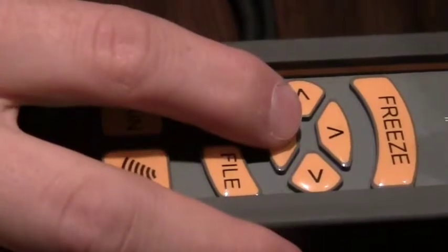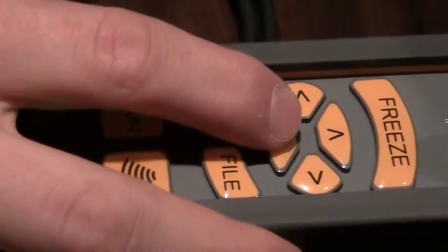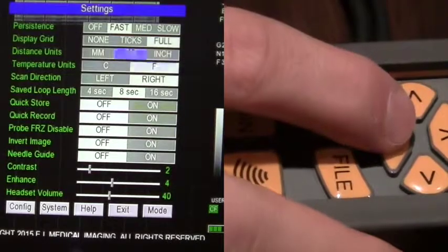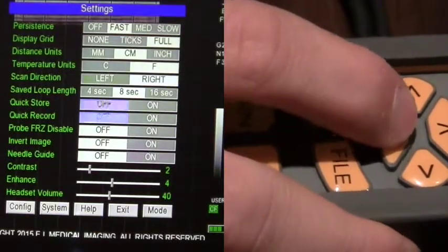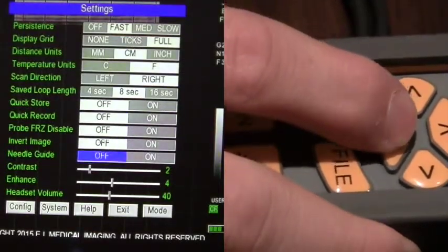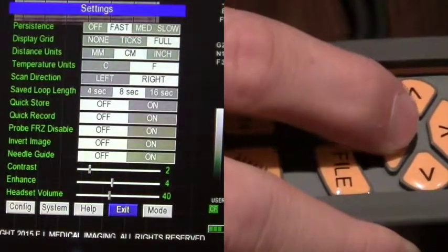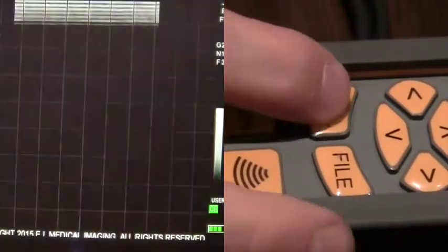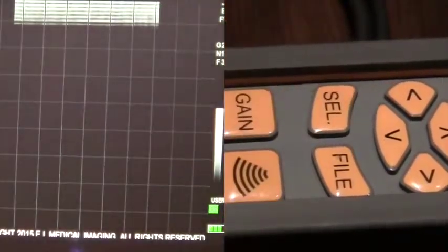Once you have the appropriate option selected, scroll down to the exit key. Once highlighted, hit select.